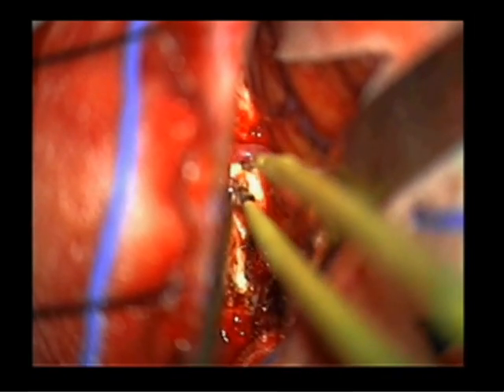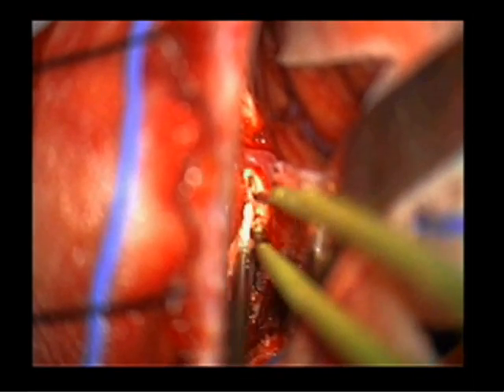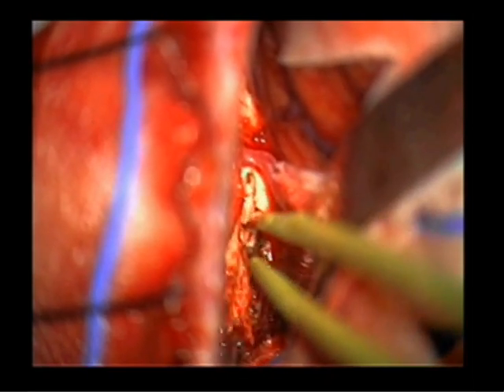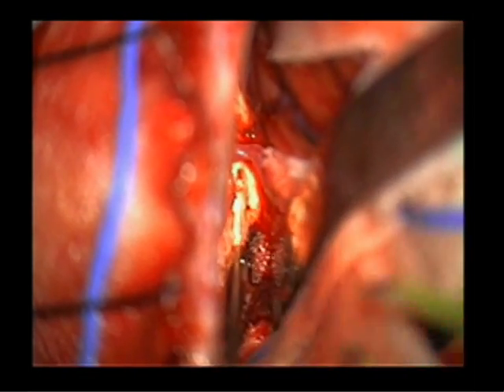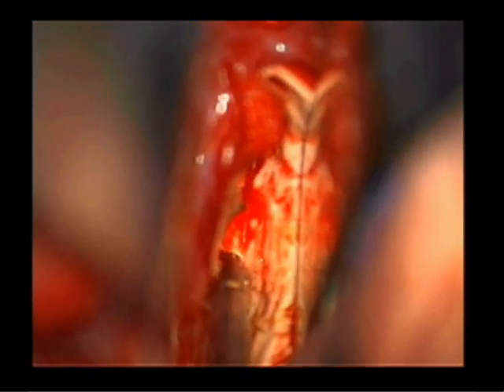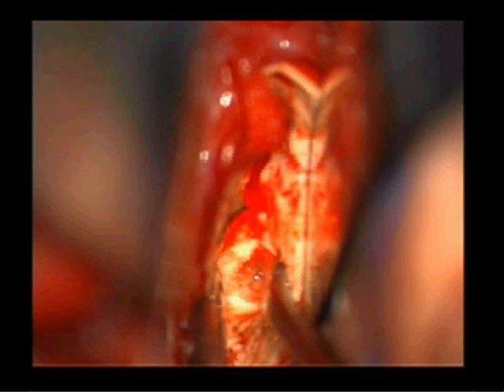The callosotomy itself may be performed with a combination of low-power bipolar cautery, suction, and ultrasonic aspiration. We find it helpful to confirm the midline with the use of frameless neural navigation before beginning the transection.